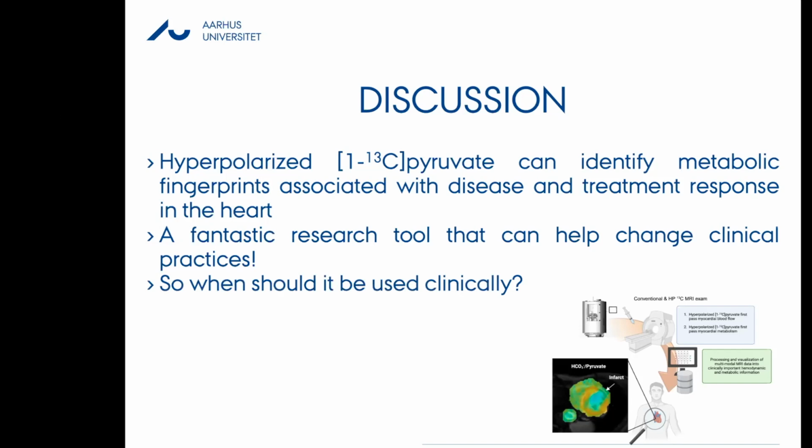But then again, when should we use it clinically? Obviously, this is a big question. I think this is an alternative to PET in many ways. If you don't have access to water PET, because that is slightly difficult to set up everywhere, this could be an alternative. So I see hyperpolarized MR as a PET MR light, with the opportunity to add this first pass metabolism on top of the hemodynamic information, so that it enables us to get similar, if not more, information than you would be able to get with a PET MR system.